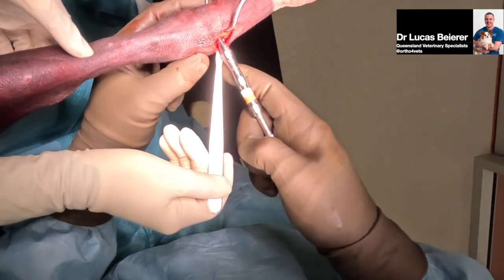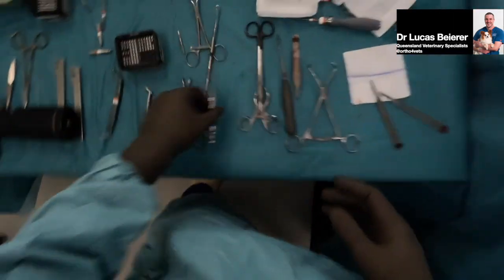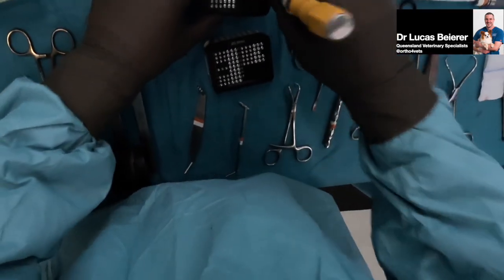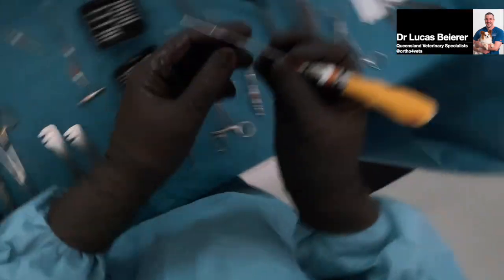So it measures 20, what's that, 26? So I'll put a 26 in because we're conscious that we have implants needing to go on the other side. We don't want to interfere with that too much. 26, 2-4 cortical.